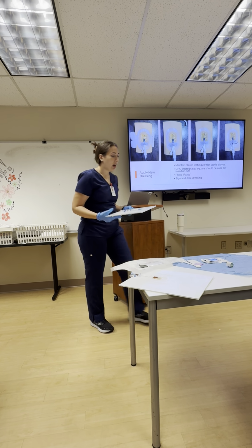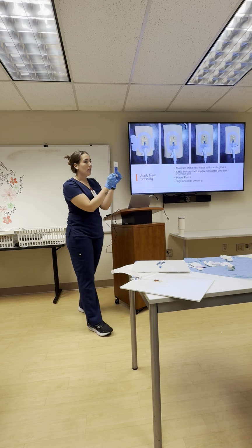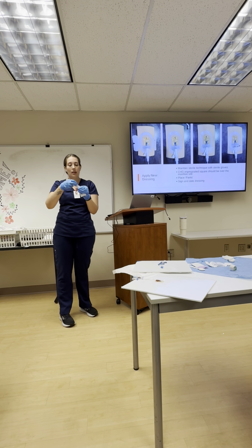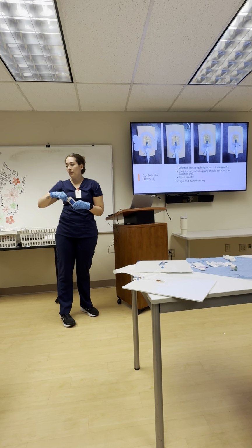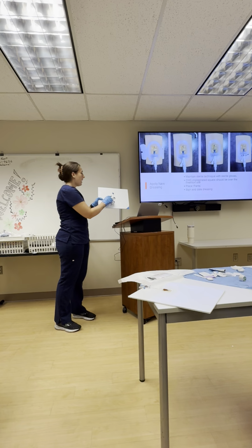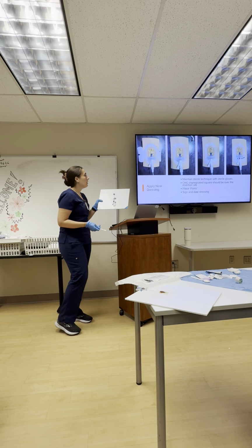Okay, once it's dry, there's a little blue package. It's called Cavilon, or this is like a skin barrier. You could use that if your patient has sensitive skin. This is just to protect the patient's skin with the dressing, and it adds like a little sticky component too, so it sticks better.